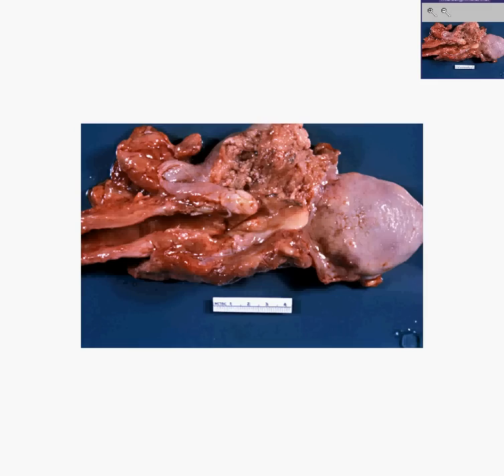Okay, this looks to me like kind of a grisly picture of a big tumor. You can recognize this as being the tongue, at least the oral part of the tongue. When you get to the back part of the tongue, the posterior third, which is the pharyngeal tongue, you could see up here the epiglottis, or at least part of it, and then you can see a large tumor mass growing in a fashion which looks like diffusely infiltrative.